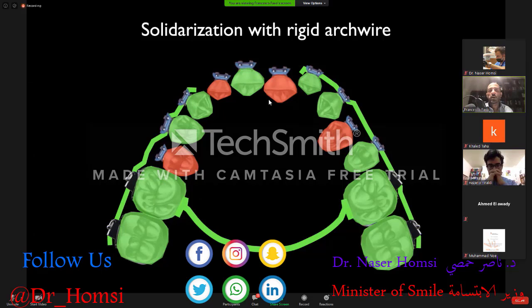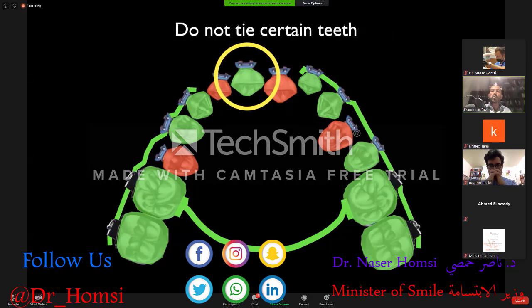Here in the frontal region we have an incisor that is supposed to be in a good position, and we might decide not to bond it. So we could even remove the bracket on this tooth, because it's in a good position and we don't need to move it at all.